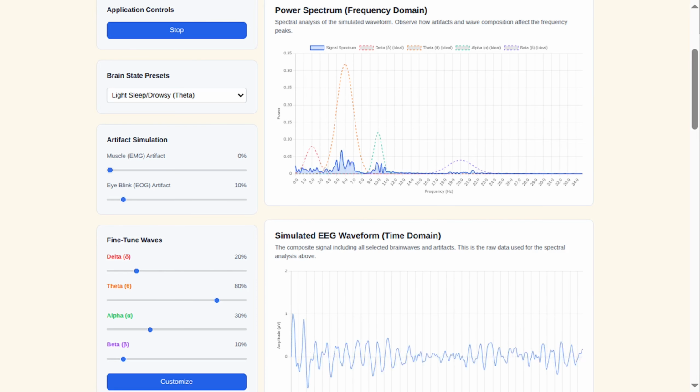Intracranial? Yes, intracranial electrodes are placed inside the skull, directly on or in the brain tissue, often for very precise measurements in epilepsy or brain surgery cases. How about locations? Besides the scalp, surface electrodes can also be placed on the face or neck to measure related muscle or nerve activity, but brain activity is mainly captured from the scalp or intracranially.